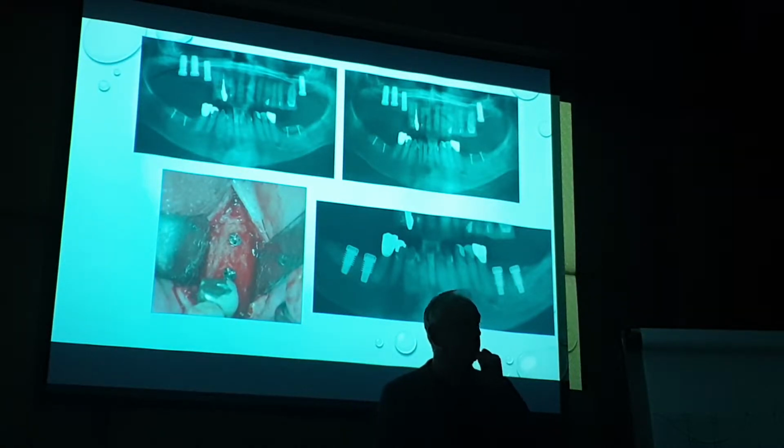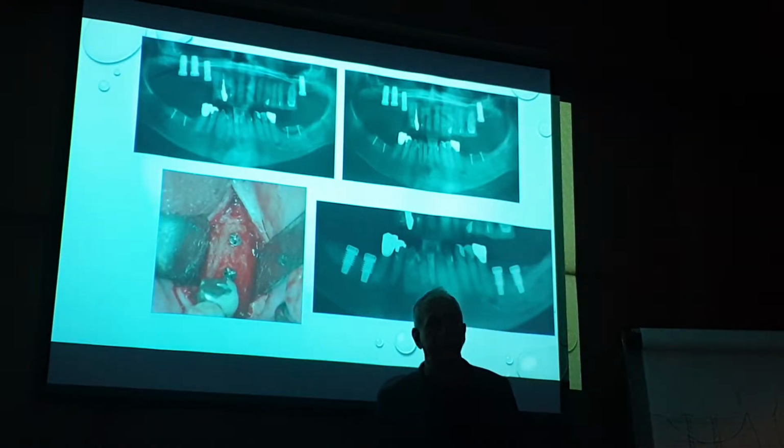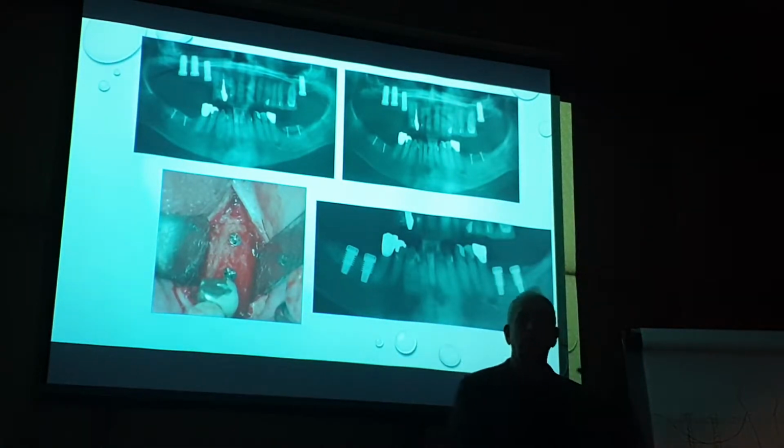When you say height, you have to tell me how much height. If you're using particulate alone, I would say 3 to 4 millimeters is the max you're going to get with particulate graft control because of scar contracture. That's why we end up with cortical cancellous block grafts or KHOURY bone plates, because it doesn't allow that tissue to retract and scar down over the top of that. You're not going to lose your volume. That's why I use the cortical bone plates here. Where volume is critical, you have to use something that's going to be there longer.